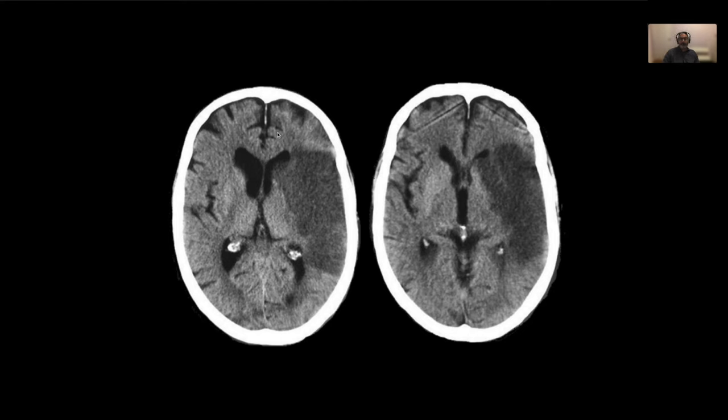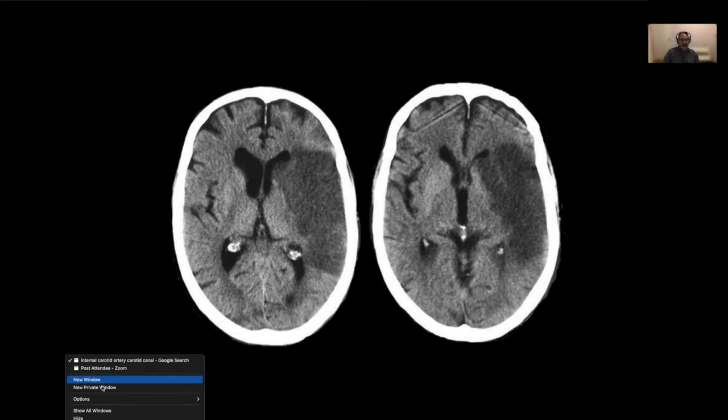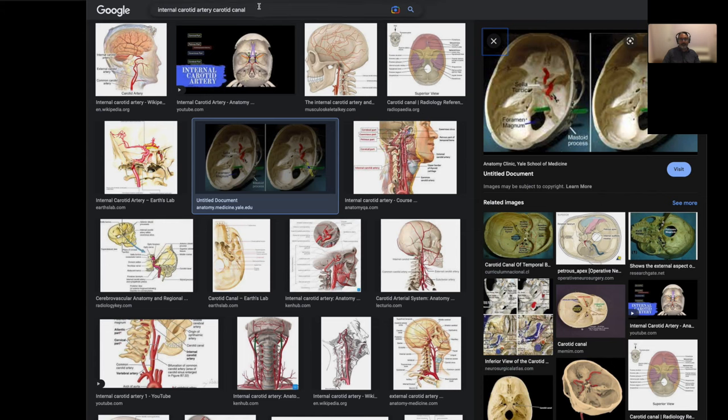I didn't mention that. But yes, you must also check for the midline and if there's a midline shift. And there is a slight midline shift. Not too much, but in certain masses or bleeding, you will see a bigger one. But yes, you must look for a midline shift there, absolutely, if it becomes asymmetrical. Now, while we're at it, let's revise the homunculus one more time.